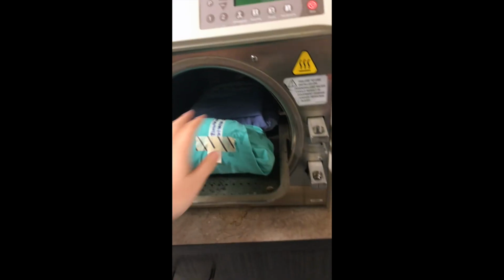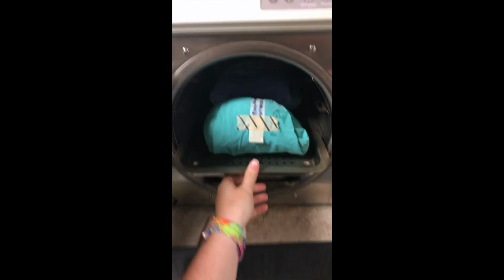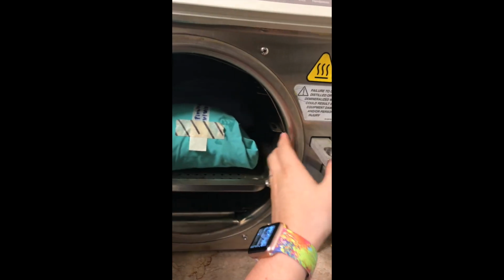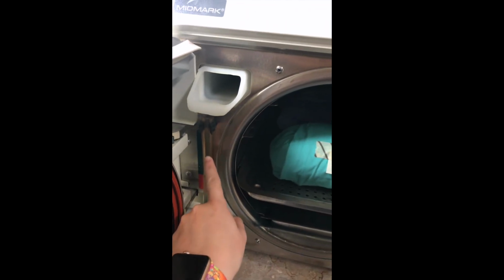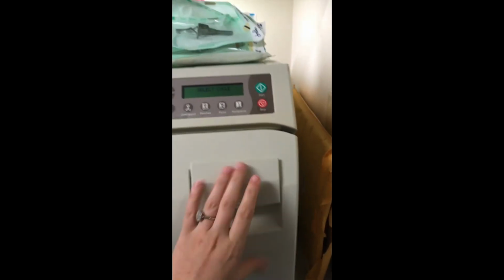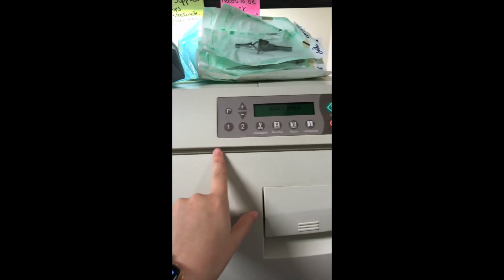To run an autoclave, you want to go ahead and get your packs that you have prepped. You want to put them inside on the grate of the autoclave. You do not want it to be stacked too full. You don't want anything to touch the internal parts of the autoclave. You want to make sure your water is high enough, and then we can close the autoclave here, set it to run.